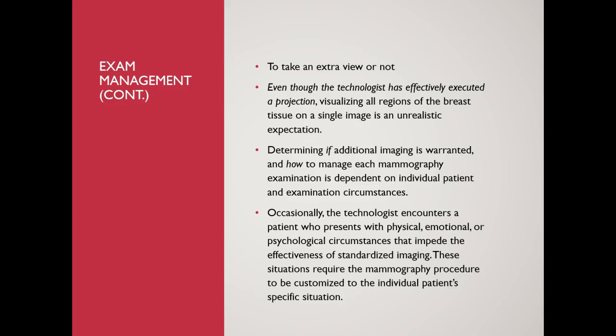And that brings into account whether to take an extra view or not. So even though you have effectively executed a projection, visualizing all the regions of the breast on a single image is unrealistic. There's no one image that can catch it all. So that's why we have to have the complementary views. In addition, we have to be able to determine if additional imaging is needed and how to manage each of those circumstances.